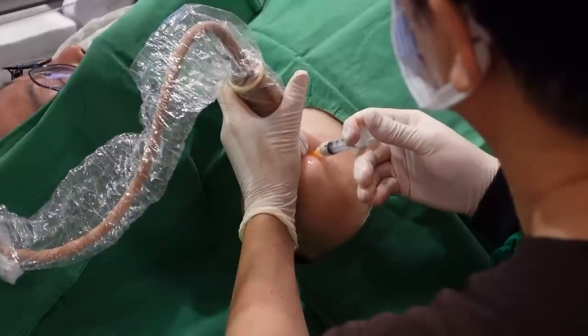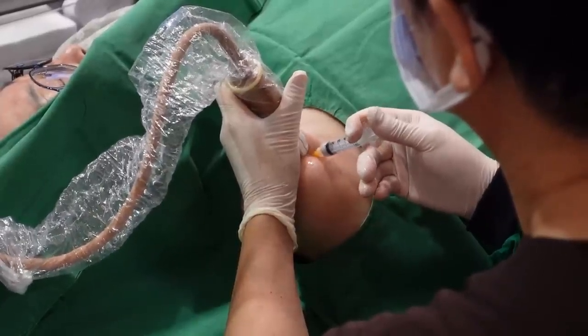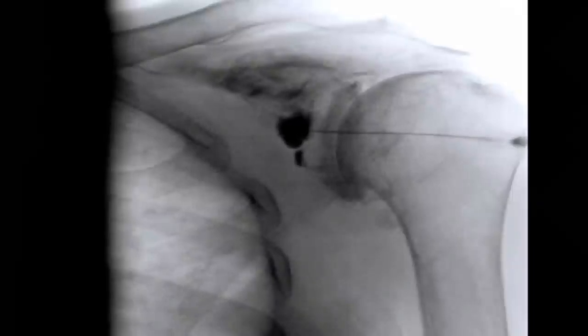You would guess the extended treatment mechanism of these injection techniques and how they work by observing the contrast spread pattern, understanding the advantage of the Botox mixture at the two injection points, and estimating the volume effect of the injectants. Botox paralyzes the stiff neighboring muscle, relaxing and allowing the glenohumeral joint to extend. The injectant volume separates the capsule and myofascial structure from the bone and joint margin, detaching these tissues from the labrum and the peripheral margin of the bony joint line. The increased gap between the joint margin and capsule allows the gliding mechanism during the abduction and external rotation.